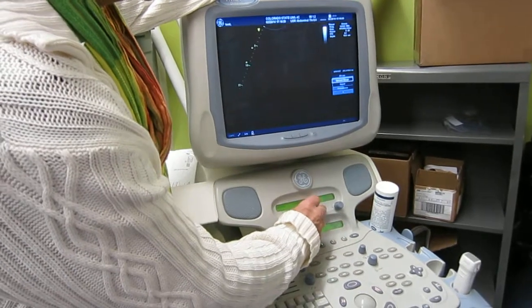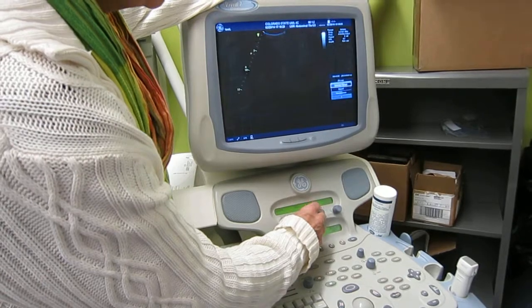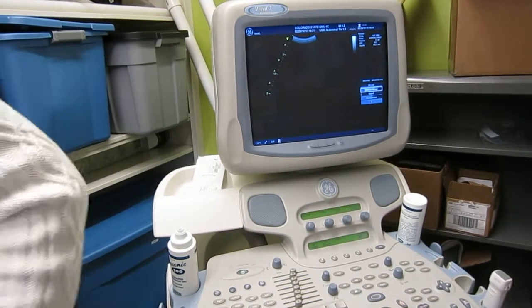And what do you know about frequency as far as imaging quality goes? We have a range here, right? What do you know about frequency? I mean, higher should be more detail, right?